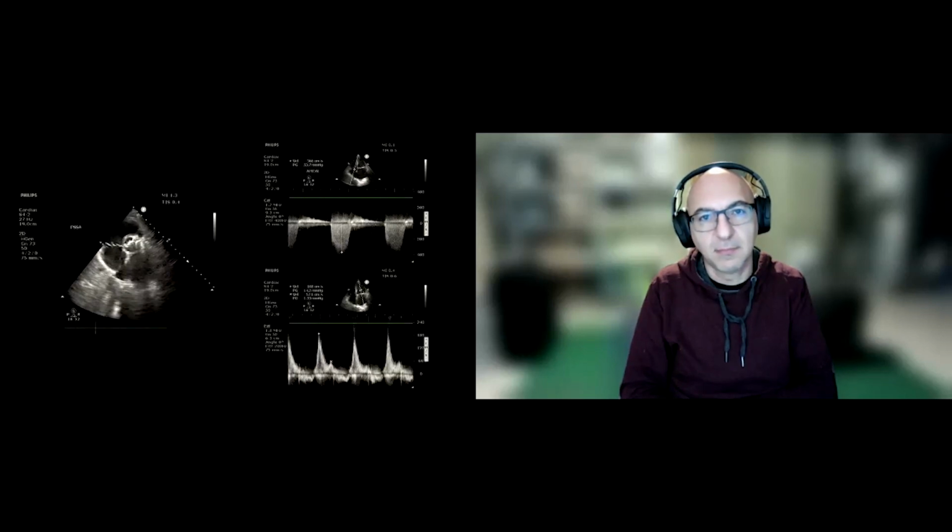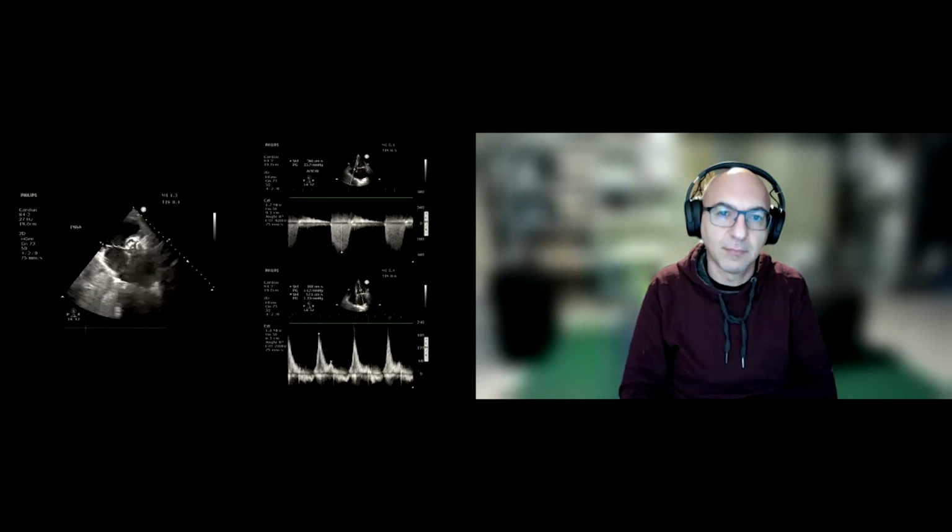This next scenario, the patient's RV takes a dump, right? So all of a sudden now our TAPSE is no longer 17, it's 10. So we have RV failure in a patient that's very dependent upon their preload and has some elevated pressures upstream from that, or downstream, whatever direction you want to say, that goes through the lungs and into the LV. Now what do we do?